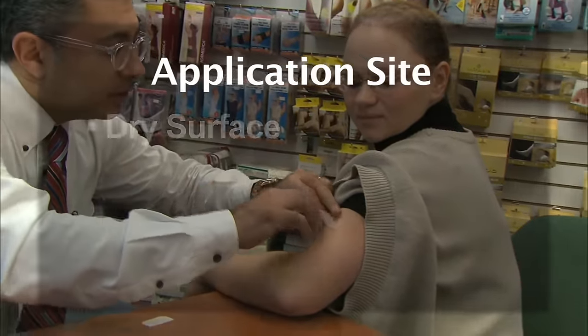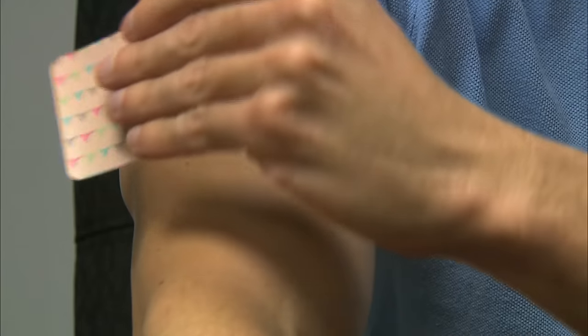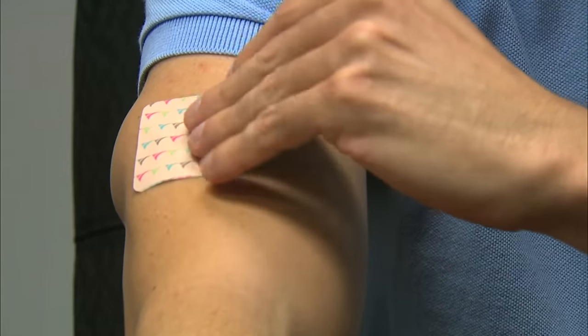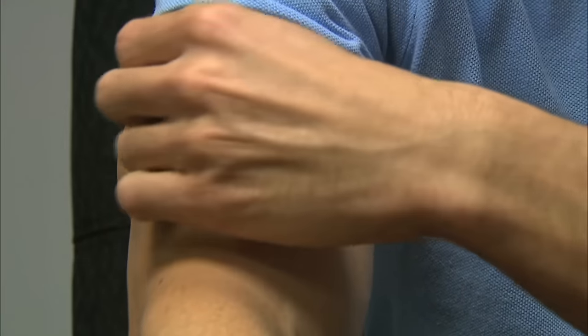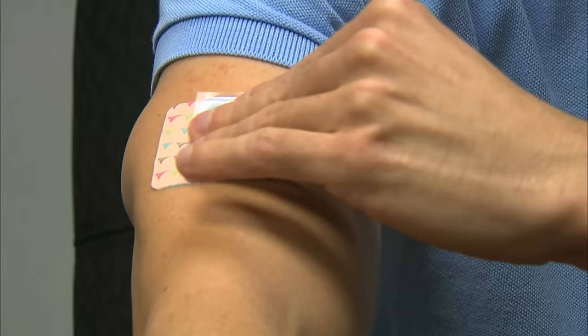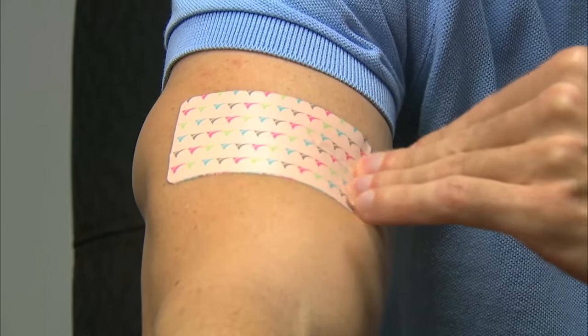The skin where you are applying the patch should not be wet, oily, or have excessive hair. Apply the exposed sticky adhesive of the patch to the selected application site and smooth down with firm pressure using your fingers over the adhesive area. While holding down on the applied half of the patch, gently fold back the other half and slowly peel off the remaining protective liner.